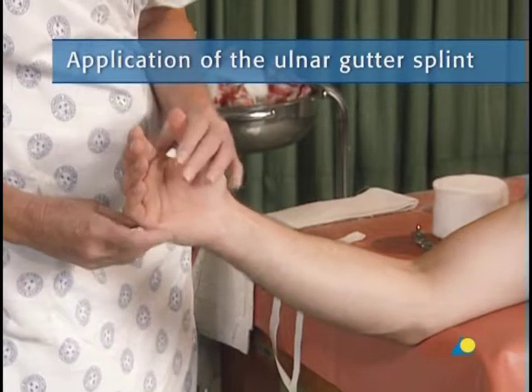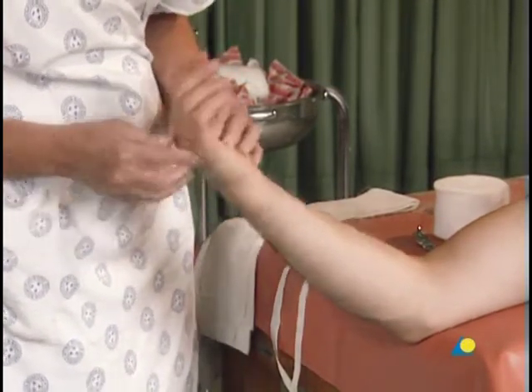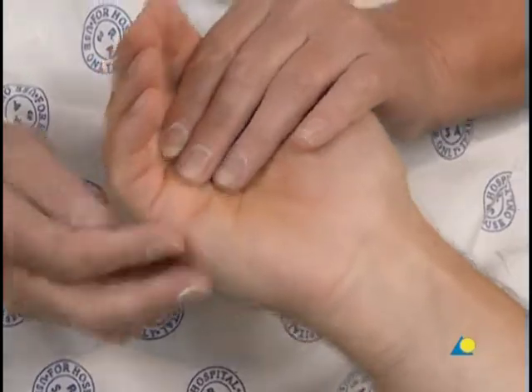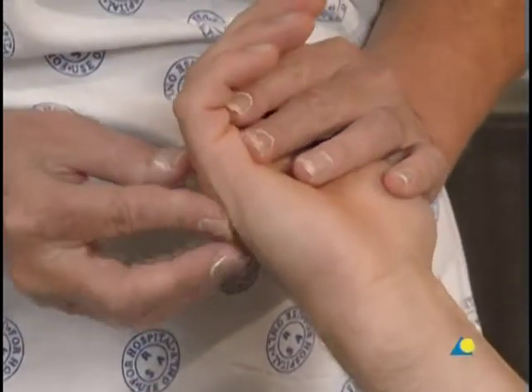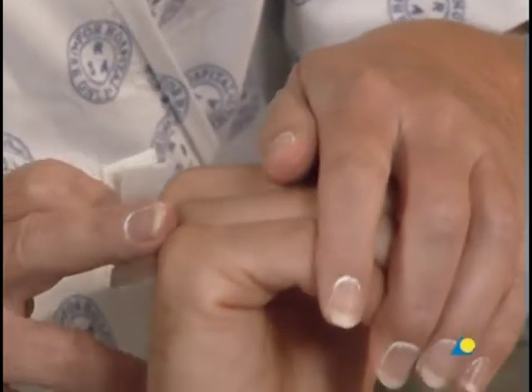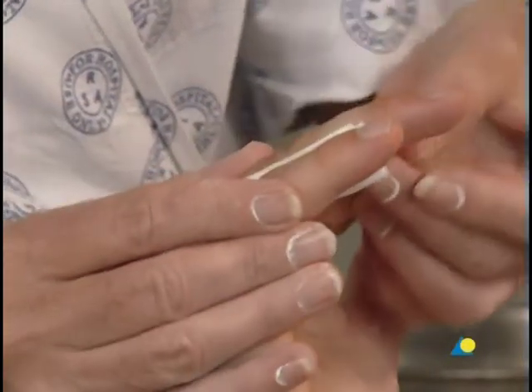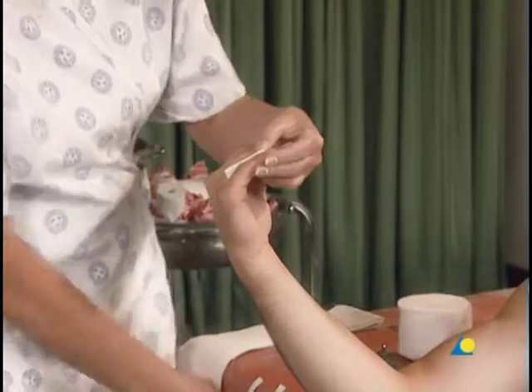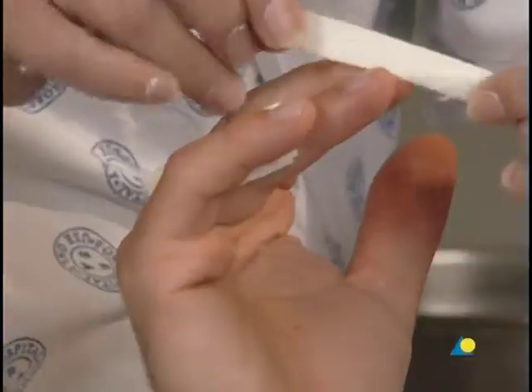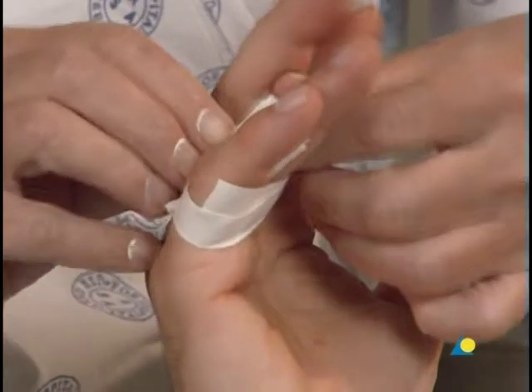To begin, the patient's hand is examined for rotation of the metacarpals. To correct any rotation or prevent the introduction of any rotational deformities, the fourth and fifth fingers are buddy splinted together. A piece of gauze or cotton wool is placed between the fingers and they are taped together. The material prevents skin maceration from skin-on-skin contact.